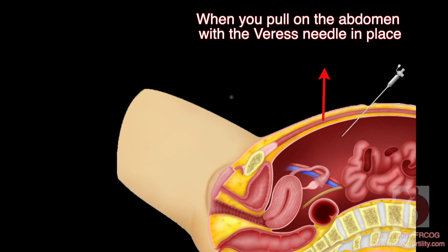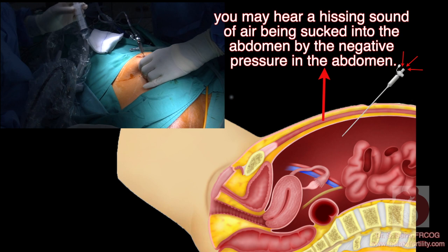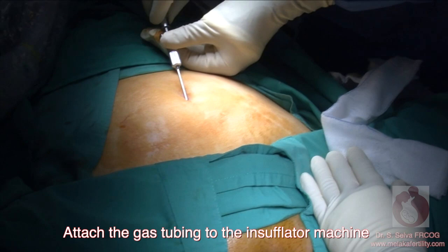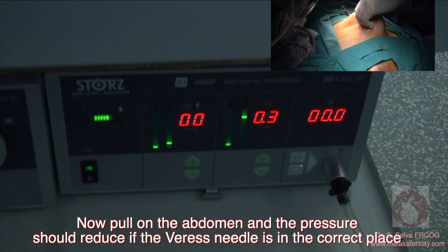Hissing sound test: when you pull on the abdomen with the Veress needle in place, if the needle is in the abdominal cavity, you may hear a hissing sound of air being sucked into the abdomen by the negative pressure. Manometer test: attach the gas tubing to the insufflator machine but do not turn the machine on. Look at the pressure on the machine — pull on the abdomen and the pressure should reduce if the Veress needle is in the correct place.